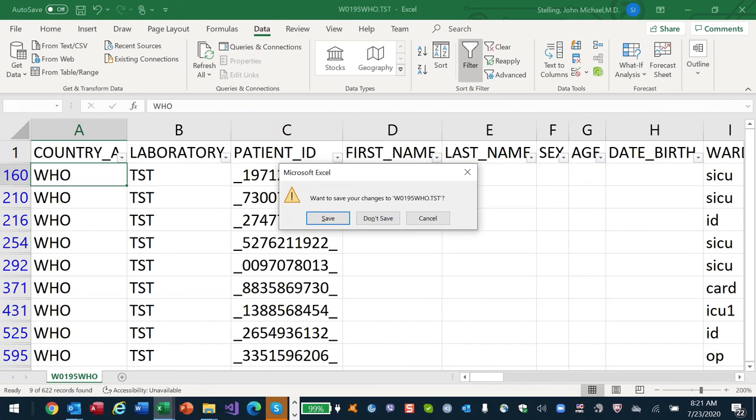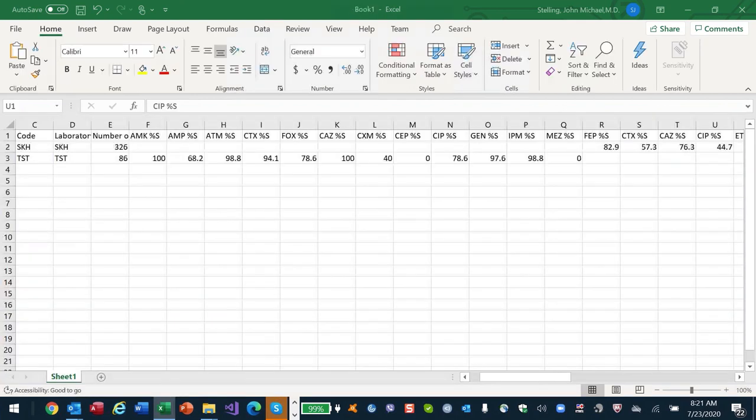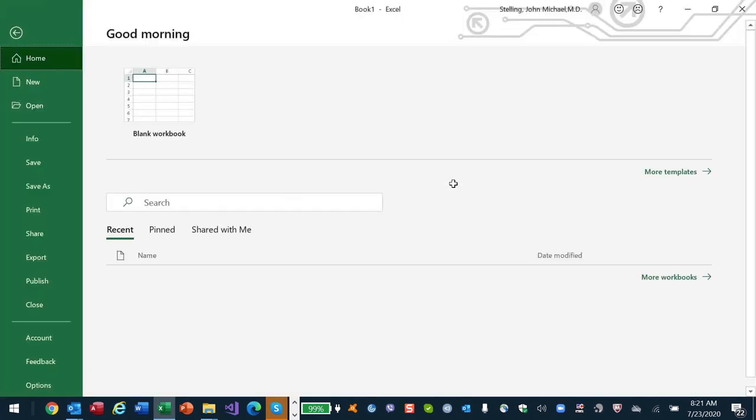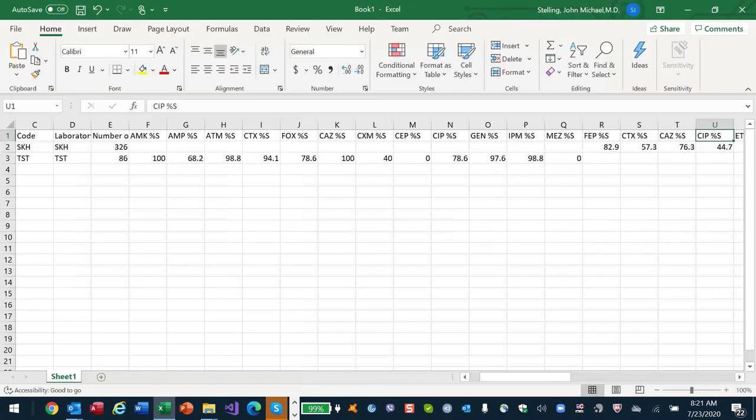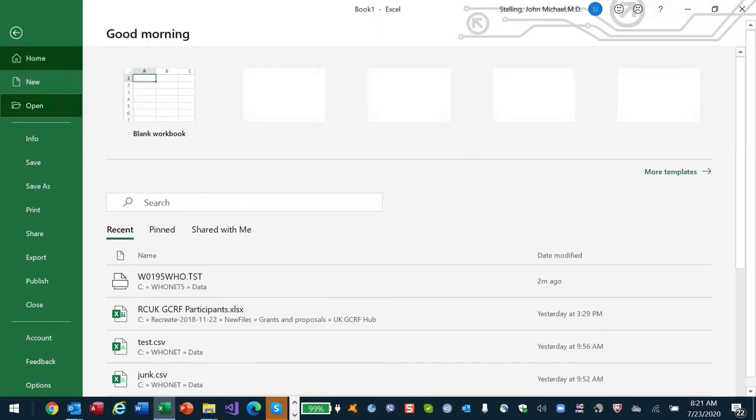So we want to take some of the, and I forgot to show you the search and replace. Well, let me do that. Let me reopen that file, which I just closed. File open, WHO tests. So you can see here that it's called cardiac surgery, but maybe I would like, I'll do this example. You just need to make sure there's enough space. I'm going to replace C surge with cardiac surgery, which is more obvious.